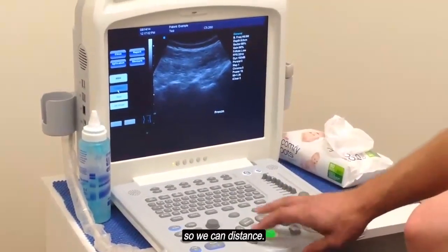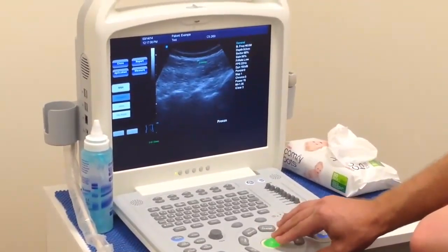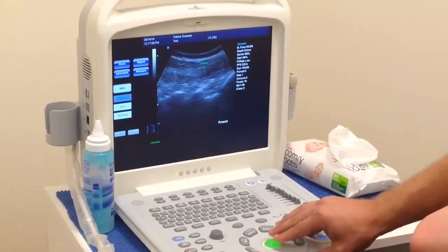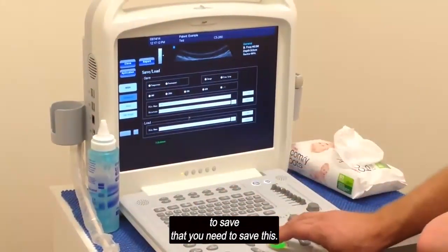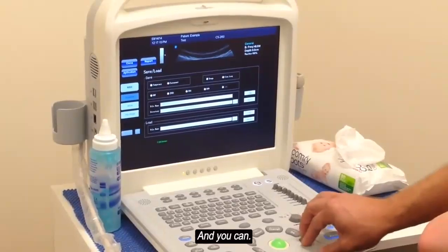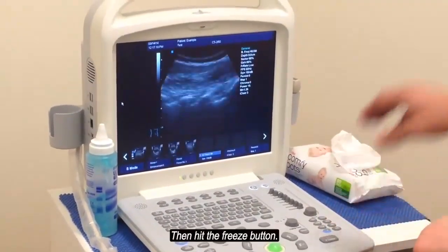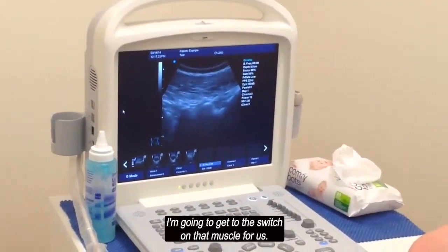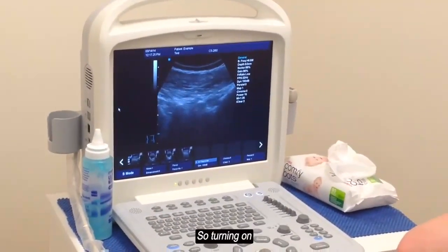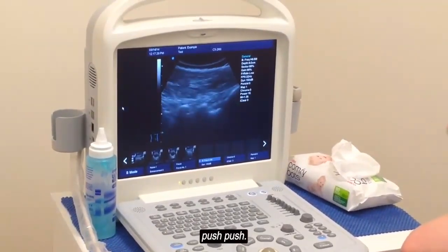So we pick distance. We set that there, then I'm going to save that image. I'll save it as a JPEG again. I'm going to hit the freeze button. We're in the same position still. I'm going to get you to switch on that muscle for us. So turning on. Push, push, push.